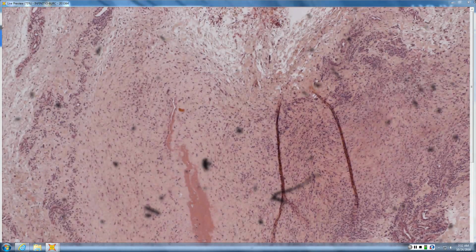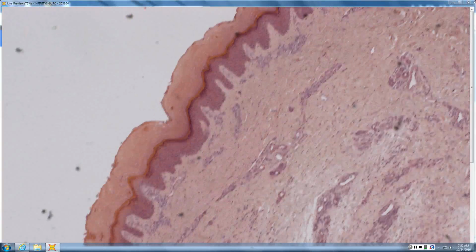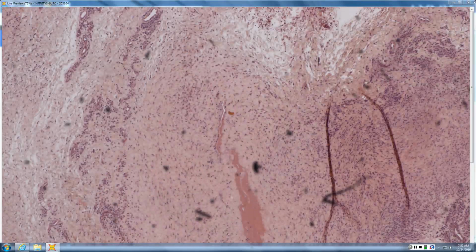So if you have palisading granuloma around fibrin, this one is not as rectangular, so maybe a rheumatoid nodule. Yeah, good for this rheumatoid one. Rheumatoid nodules, deep GA, that's your differential. So what is the clinical for deep GA?